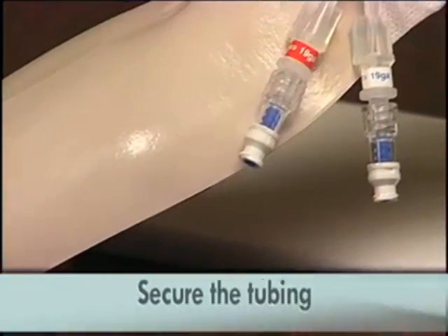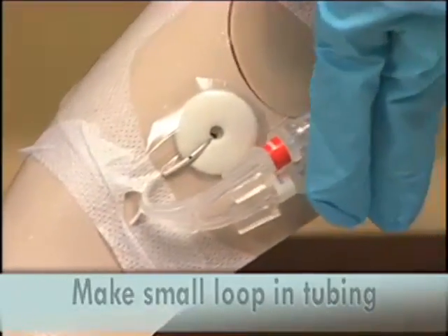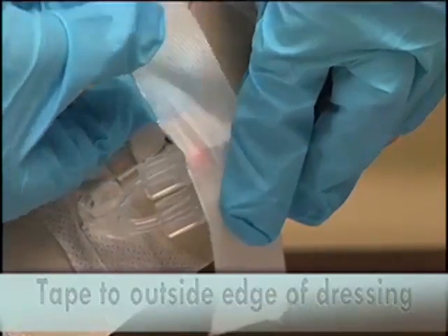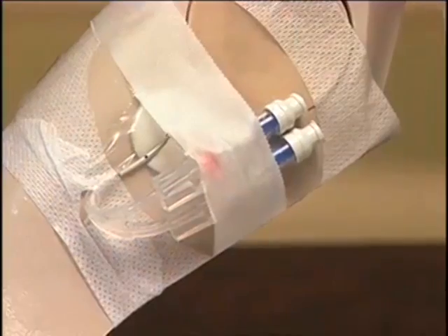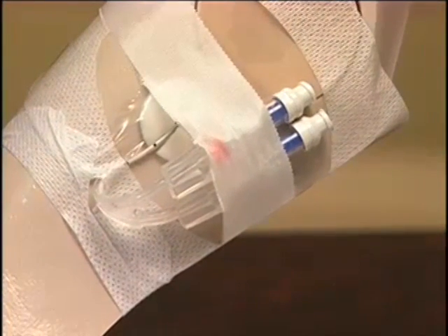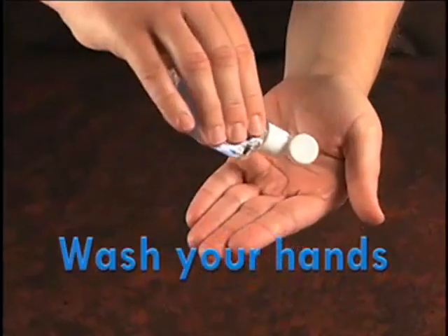Affix the tubing to your skin. Make a U-loop with the catheter and tape it securely to the outside of your dressing, with the end cap facing upwards. This will secure the tubing to help prevent excess tension on the tube and reduce the risk of dislodgement. Wash your hands.